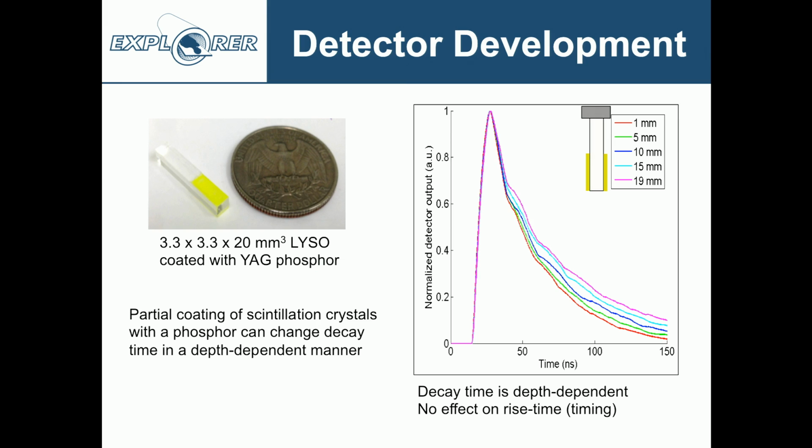And that's something that's not been really integrated into commercial systems so far, primarily because there hasn't been a need, because the axial field of view is short. We don't have these really oblique angles in current scanners. So this is something we really need for this project that has not been needed so far for commercial scanners.